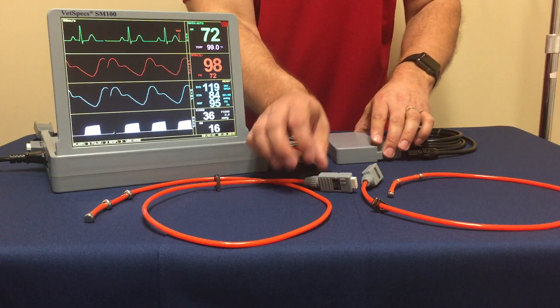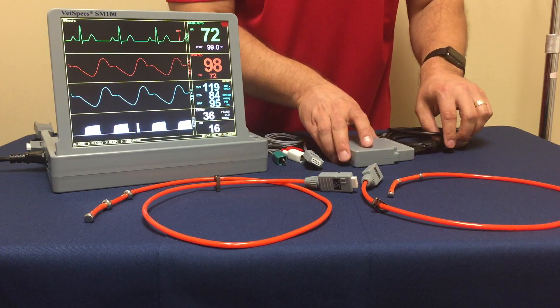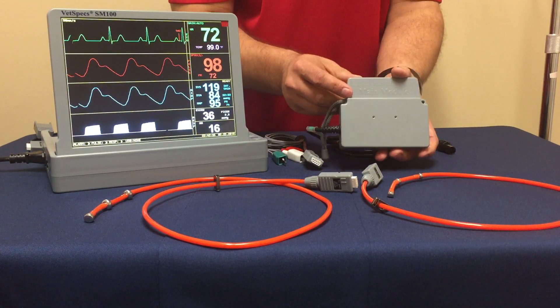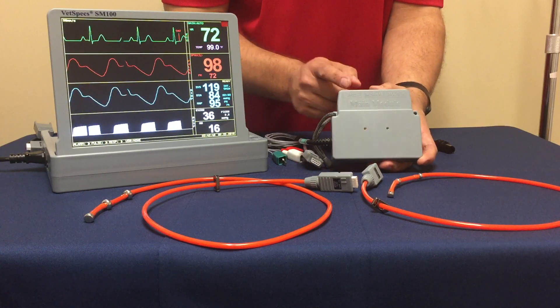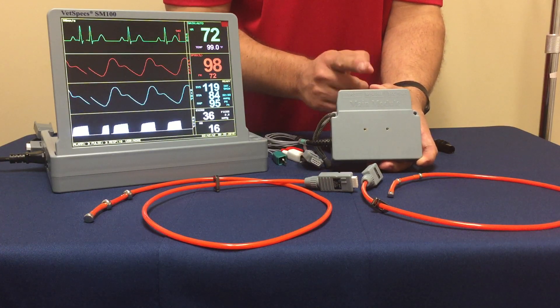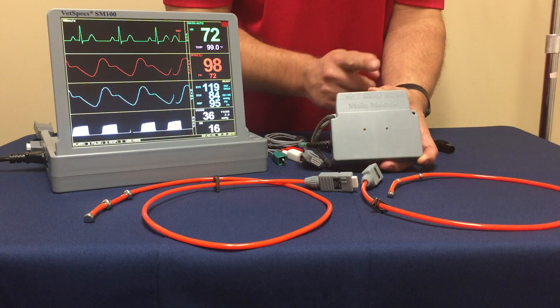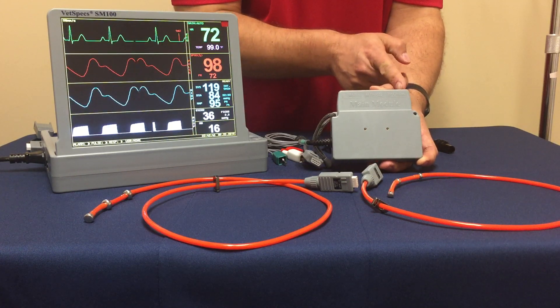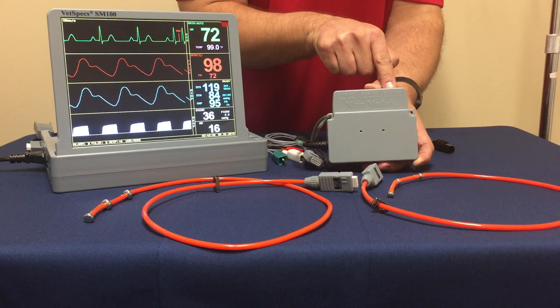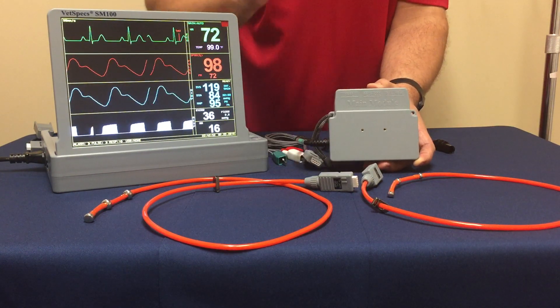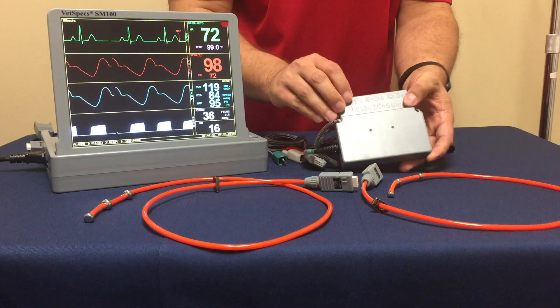As for connecting the esophageal probes, this will connect through the main module that comes with the VetSpecs systems. The main module has your SpO2 port, your respiratory CO2, and then your ECG temp port. You can plug your esophageal probes directly into the port and you're going to be getting your temperature, ECG, and heart rate.